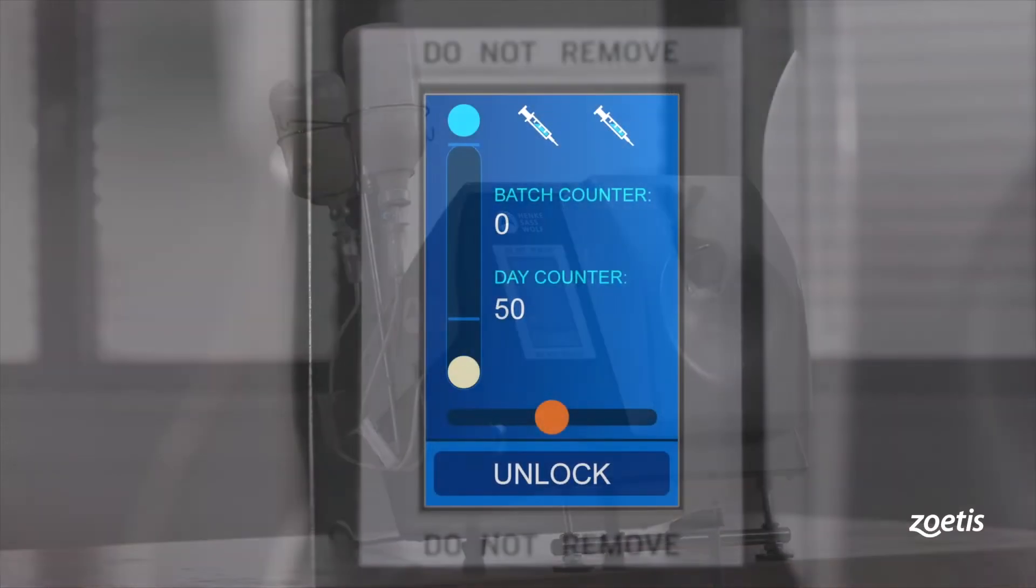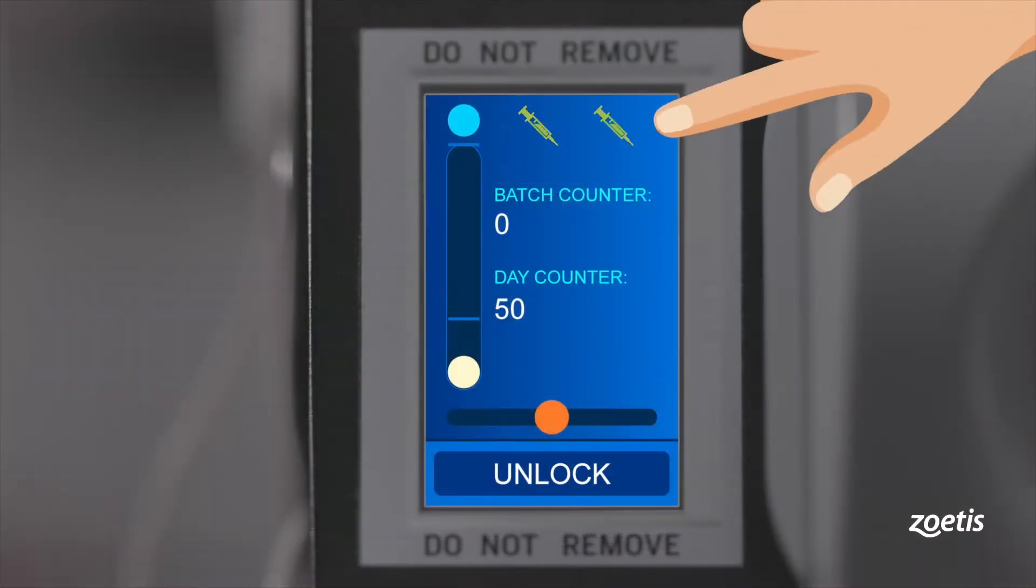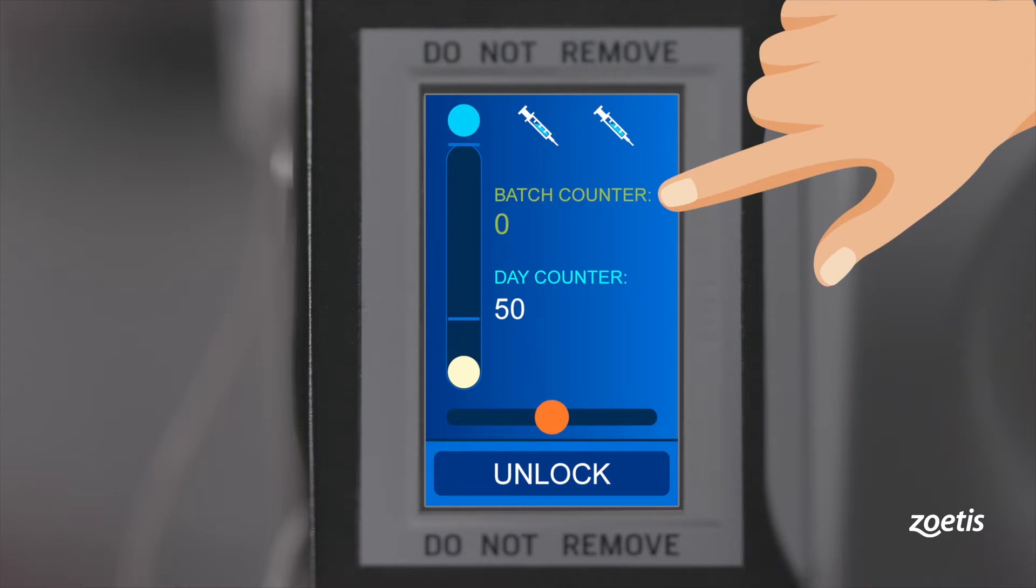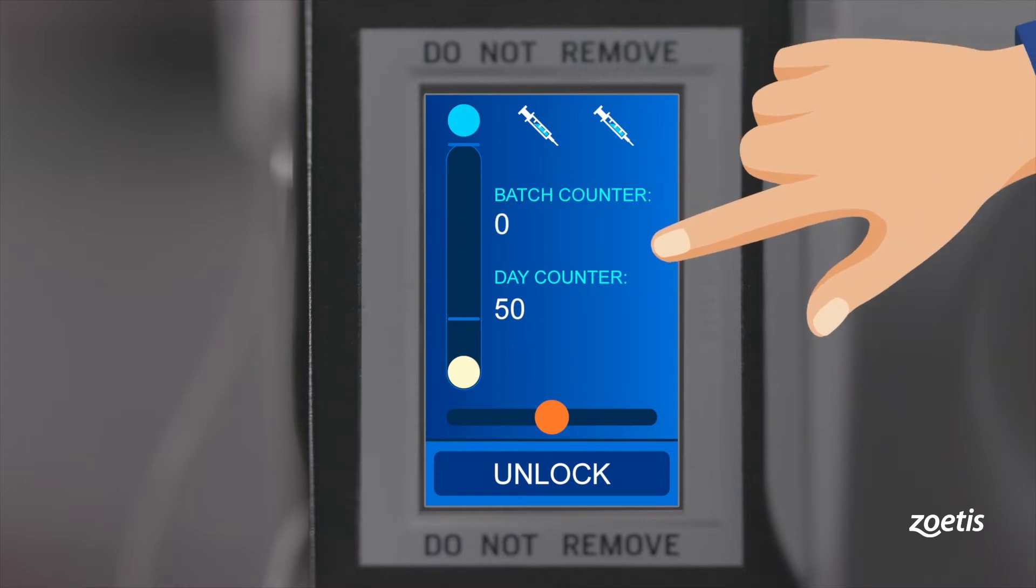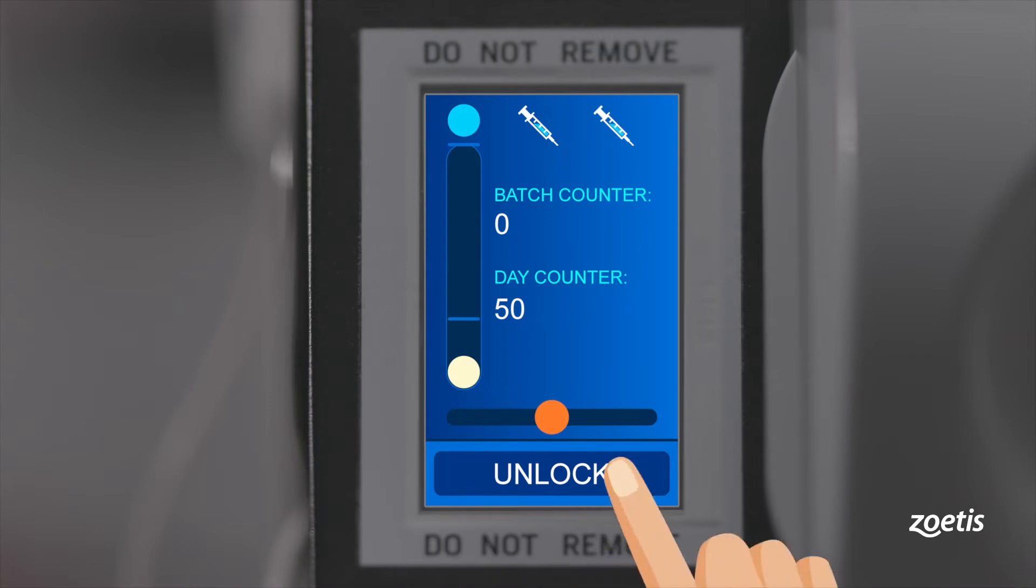The home screen shows basic information like how many syringes are in use, a batch counter and a day counter. It also indicates the correct positioning of a chicken. Hold unlock for two seconds to access settings.